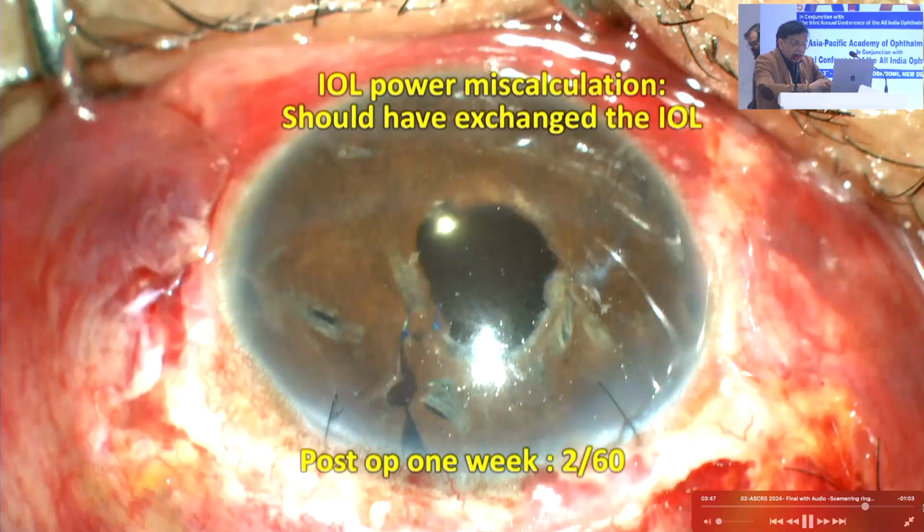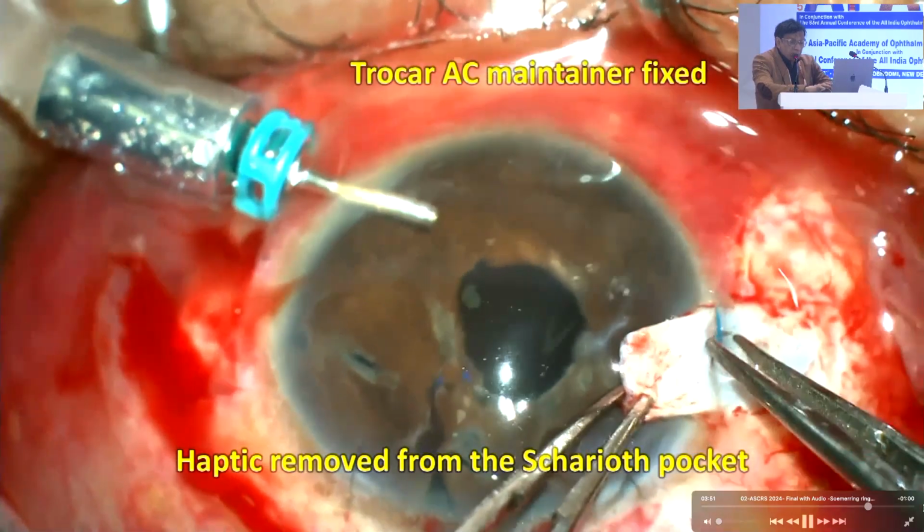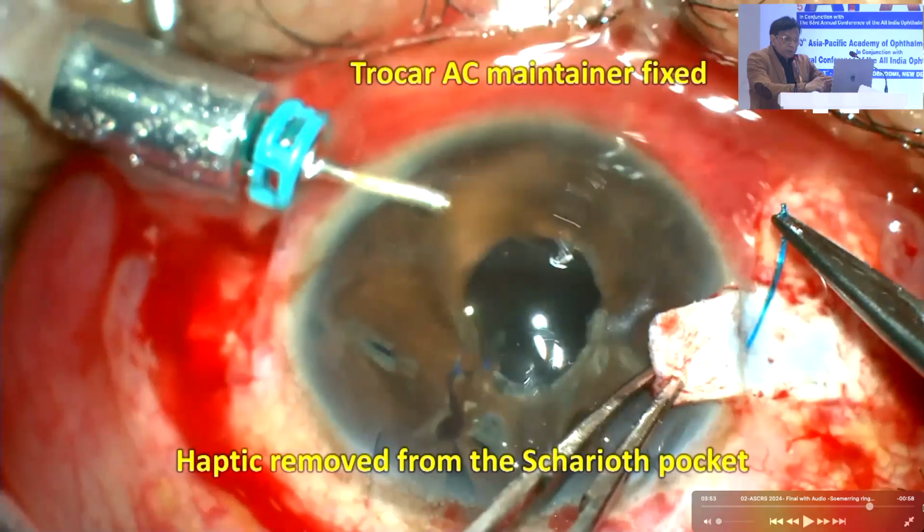So anyway, now the question comes, what to do, Rohit? What about you, Gaurav? The power was too much for me to do a laser on him, okay? The cornea is not thick enough for me to do the laser. So, Gaurav? Yeah, so you'll have to go for an IOL exchange, sir. I think there's no other choice. So that's the only way I could do it, but Kumar, there's a small problem here. I already have created a small pupil. Now, what would I do, Kumar?